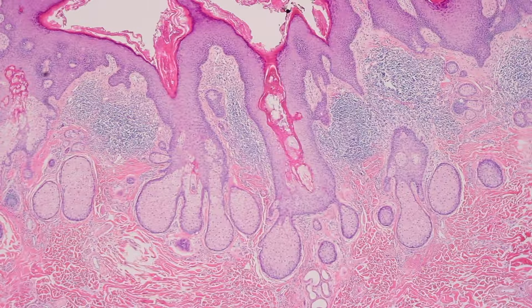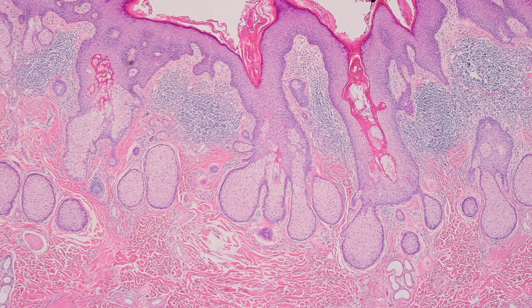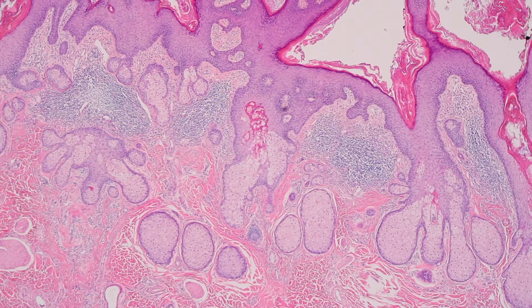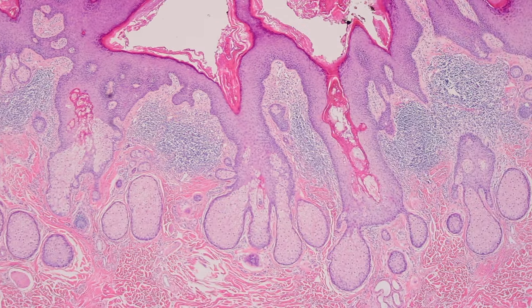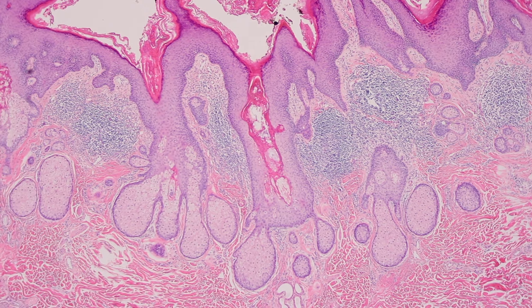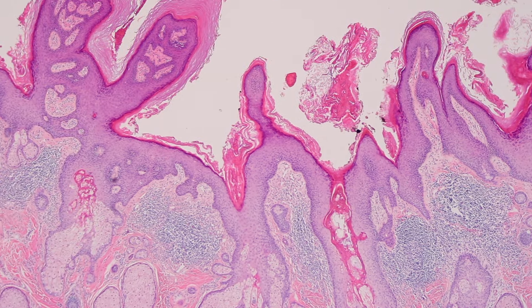The second thing you'll usually see is really prominent sebaceous glands. They tend to be larger and more prominent the older the patient is — in teens or adulthood after puberty, they're really large and well developed. Normally sebaceous glands drain directly into hair follicles, but here they're draining directly to the skin surface — straight up without any hair involvement. They're not connected to a hair follicle.